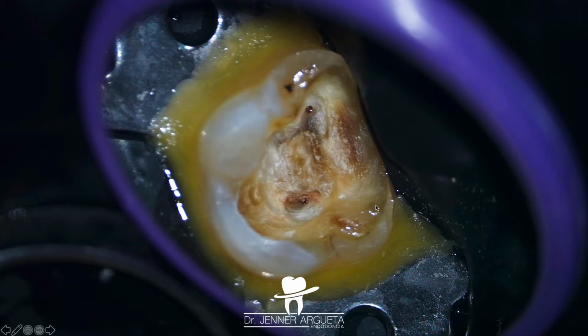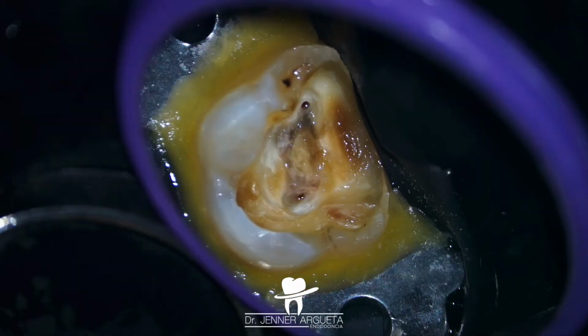And one clinical tip that has helped me a lot and I will share with you today is to place some sodium hypochlorite in the area of interest. The sodium hypochlorite will hydrate the tissues in that area and will offer us a better understanding of the area to treat.